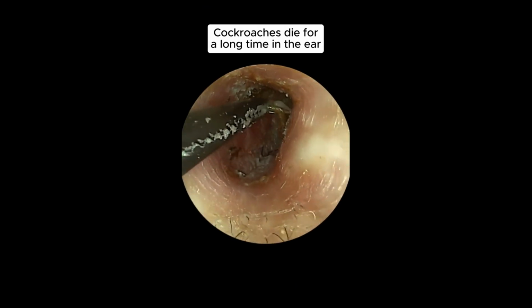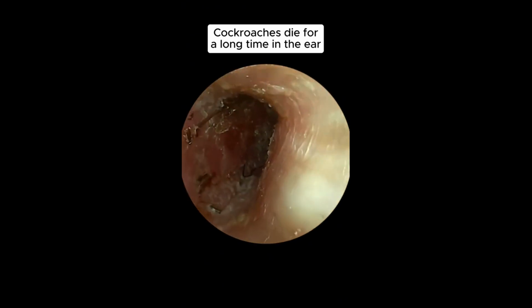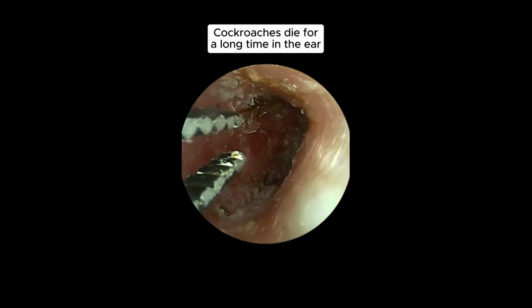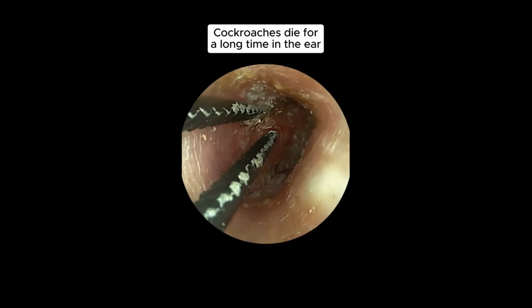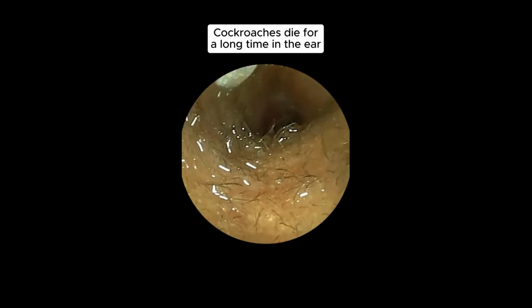So what we're going to do is go in, and I'm going to point out bits of anatomy to you. I'm going to pause it right here. Okay, so that is the eardrum. I think it's not too difficult to identify because although it does look extremely weird, it has that bluish-grey tinge that you would expect from an eardrum.